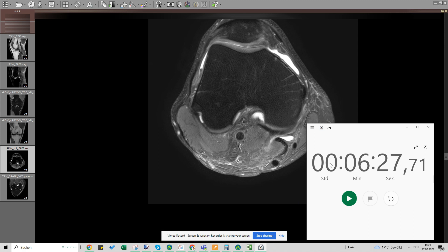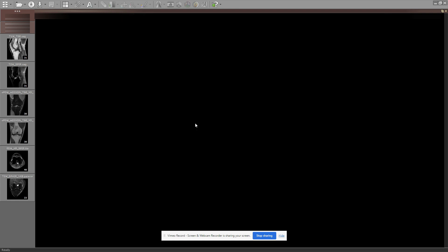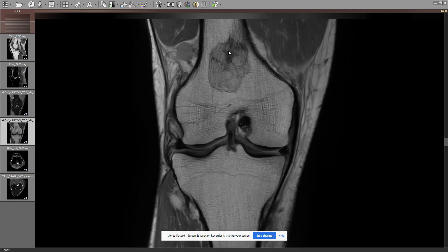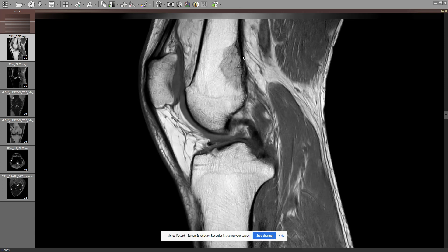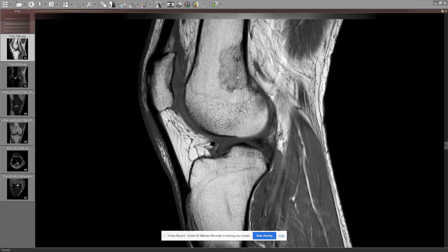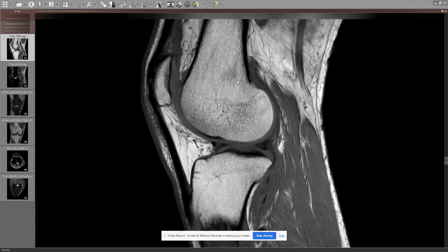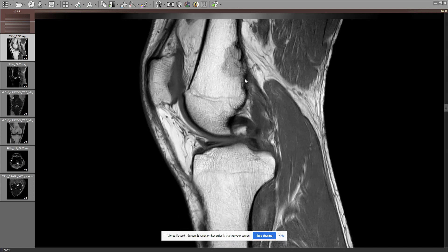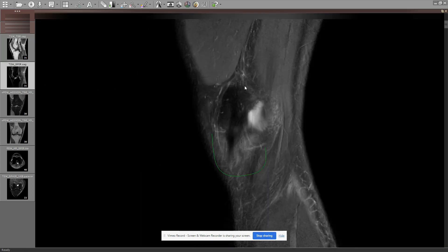So we're looking at the six-minute range, maybe almost a bit more extensive than I would normally be. Would you be interested in trying this on your own? I forgot something — we just saw in the speed run this funny lesion here but forgot to look at it in the normal run. Maybe just a concentration question. It could be a hemangioma — it's fat-containing. It doesn't really look like a typical torque lesion. It's a benign, fat-containing lesion.